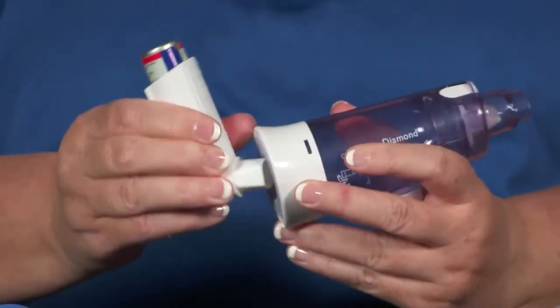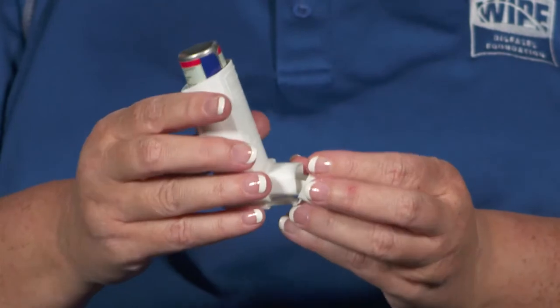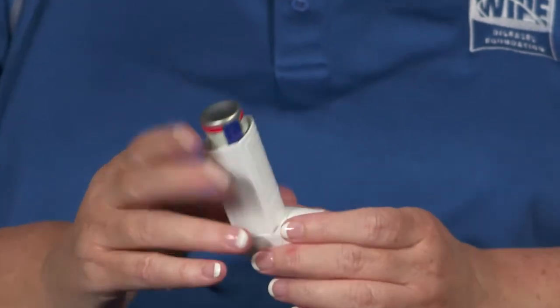After you finish, take the MDI away from the spacer, close the covers, and make sure that you hear it click like this so you know it's closed. If your instructions say to take another puff, then wait about a minute. Then open the caps and do everything like you did before, starting with shaking.